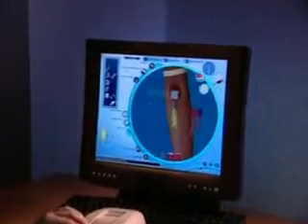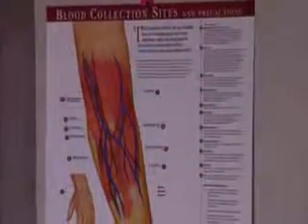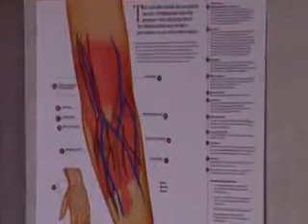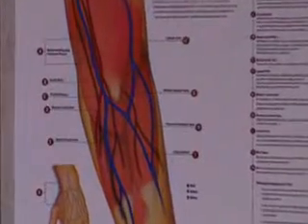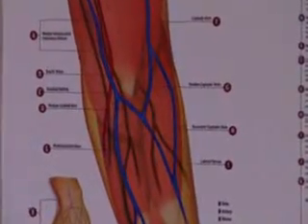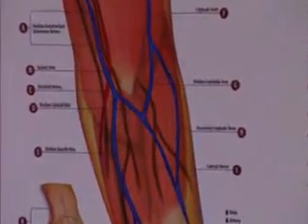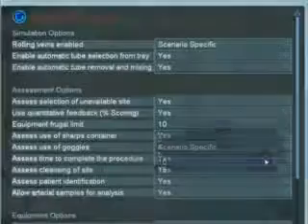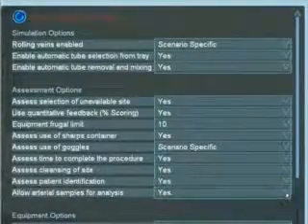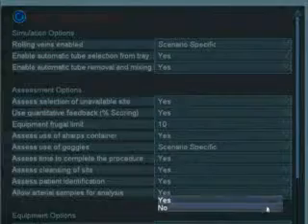Virtual Phlebotomy conforms to all relevant standards and guidelines developed by the Clinical and Laboratory Standards Institute and the Occupational Safety and Health Administration. A host of instructor-configurable options allow the system to be configured to local guidelines and protocols.